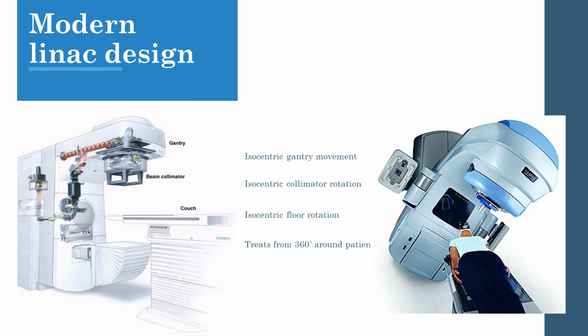The image on the right is what you will become more familiar with. As before, there is a rotational gantry and collimator. The patient is still on a similar couch, which also rotates, and the machine still moves around them. However, as well as the imaging panel opposing the gantry head, which is folded away in this image, you can see two perpendicular arms. These can take kV images of the patient, which are much higher quality, and in this particular case, can even perform a CT scan of a short length of the patient to assist in the setup. This is called a cone beam CT.